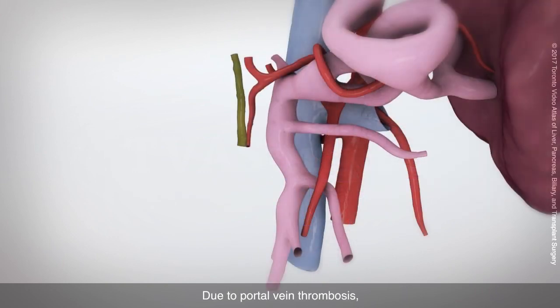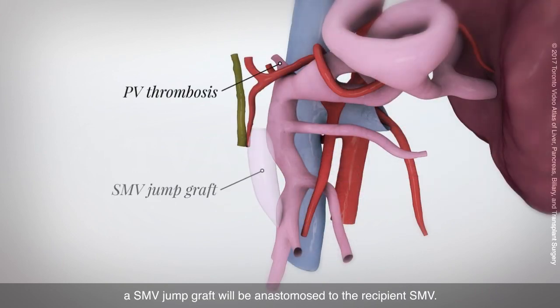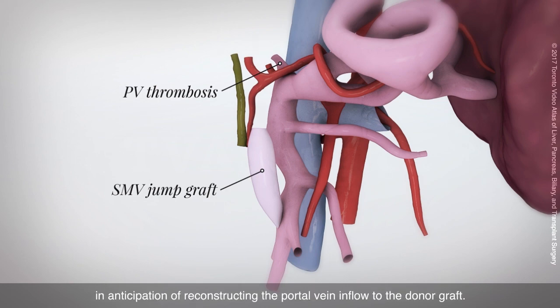Due to portal vein thrombosis, an SMV jump graft will be anastomosed to the recipient SMV in anticipation of reconstructing the portal vein inflow to the donor graft.